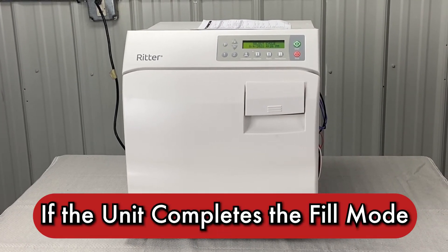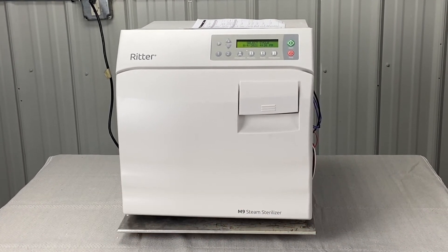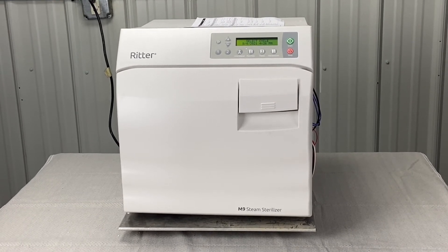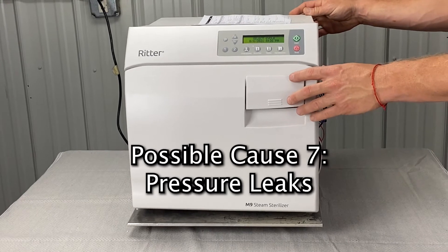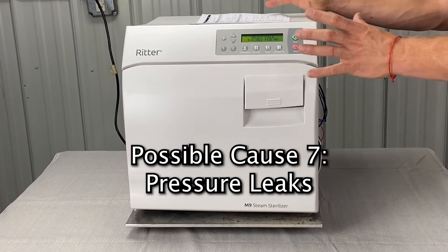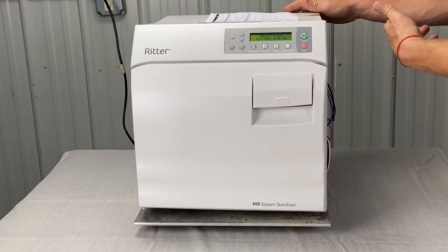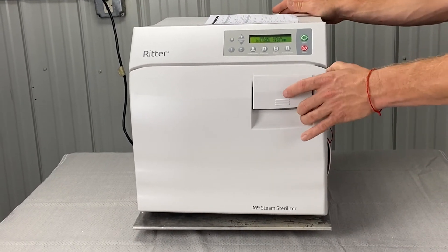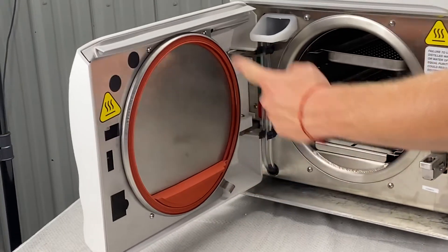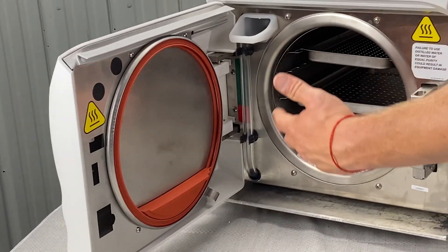If the unit does complete the fill mode, that would indicate the water level sensor is in good condition. Then we're looking for pressure leaks — somewhere the unit is leaking pressure, causing it to run out of water, which causes it to overheat and trip the thermostat. It's either going to be the door or the dam gasket — you'll want to look at the dam gasket and make sure that's not leaking anywhere.